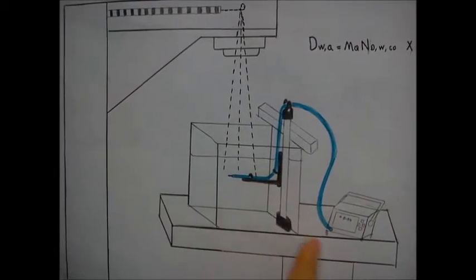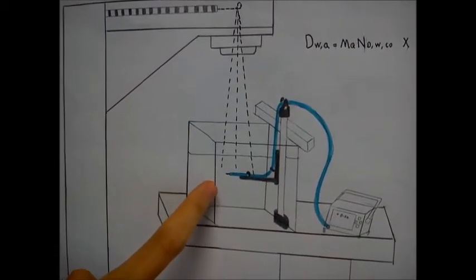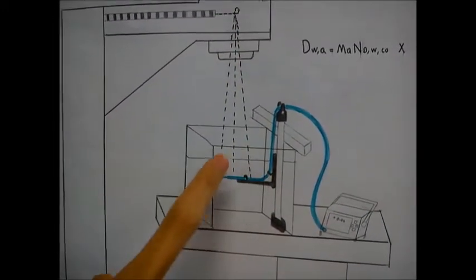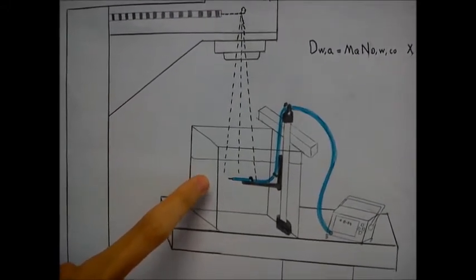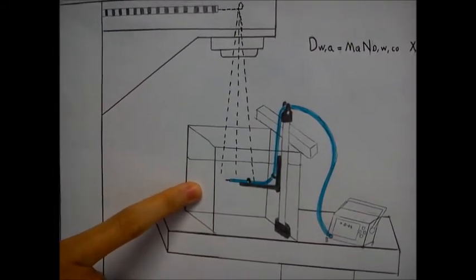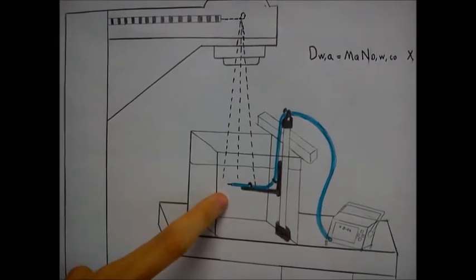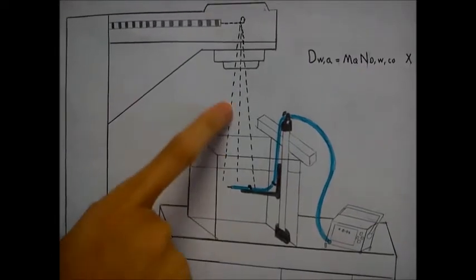We use a water phantom that we place on a patient table for the symmetry measurement of a photon beam. We use water as a standard phantom material because about 70% of the human body is made up of water, so interaction with water is the main basis for calibration of megavoltage photon beams.